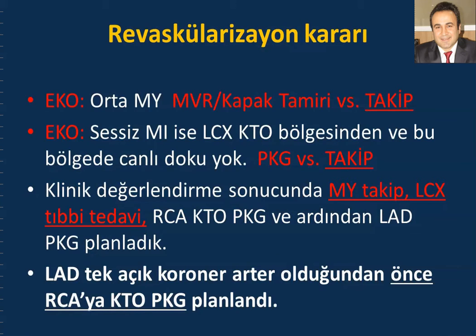But we re-evaluated the patient and we found that mitral regurgitation is not severe. We just follow the mitral regurgitation, and circumflex chronic total occlusion PCI is not required in this patient because of no viable tissue in the circumflex territory, and LAD was the only open artery.